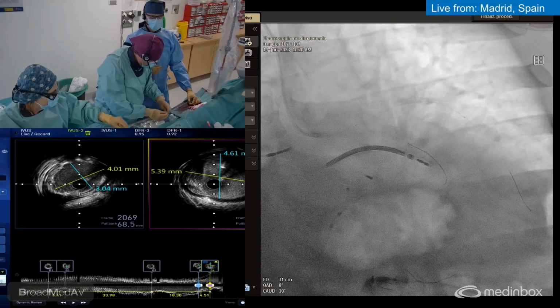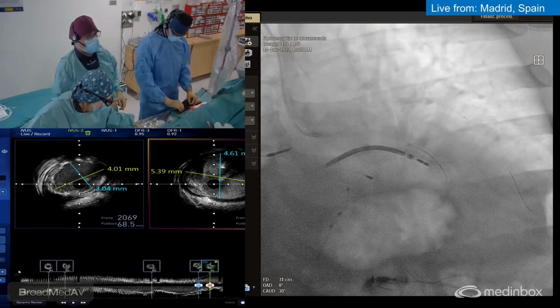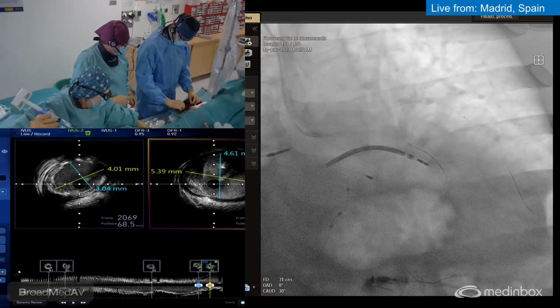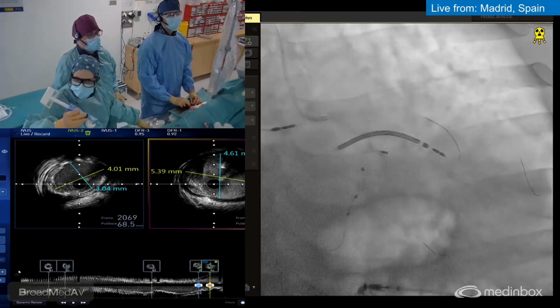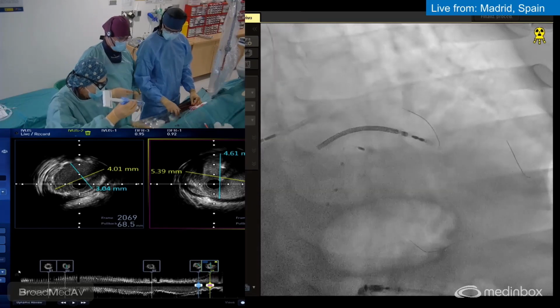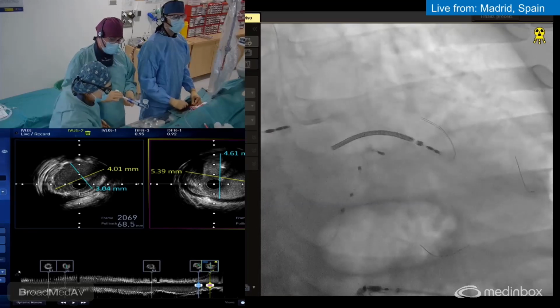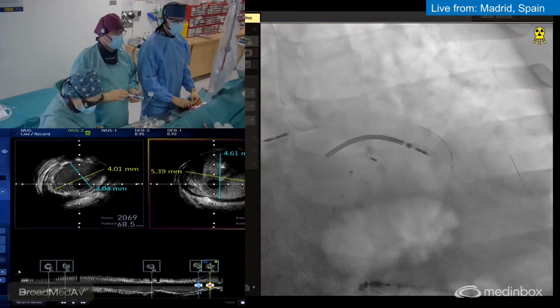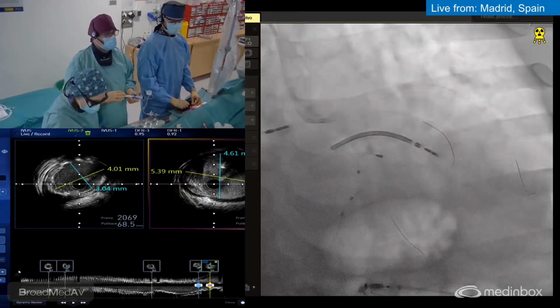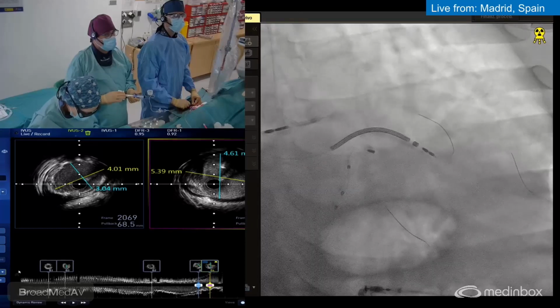Danny, in the chart, which is the maximum diameter of this stent, please? The chart. 3.5. I think you can go up to 5 point 5 something. 5.0 maybe. And probably in bench studies, they go up to 5.6, if I remember well. Okay. Let's be focused on this part because we have to implant the stent. Yeah, up to 5, I think. 5 is the maximum diameter. Let's go. Let's focus here.